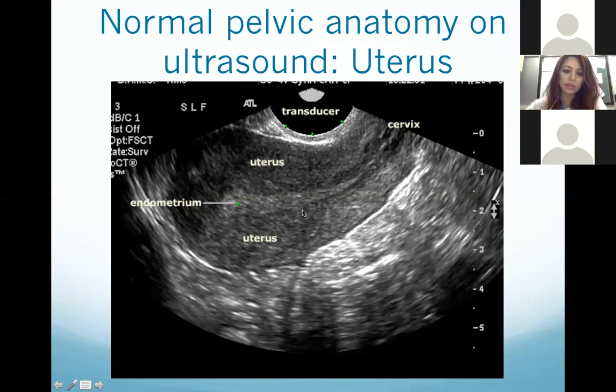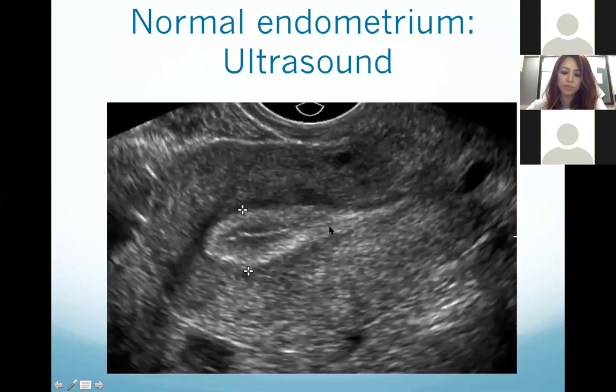Here you can see clearly the endometrium — the white thing — and the surrounding area is the myometrium.